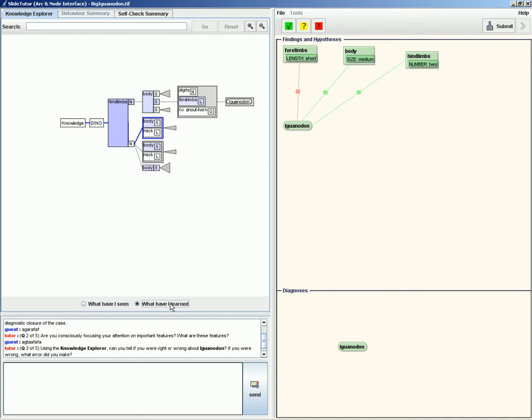What you've seen indicates obviously things that you've seen in the case, in the tutor. The current case is going to be this bright green color that you see here. And anything that you had seen earlier with the tutor, those paths will be colored a light green color. But the current case is this bright green color that you see here. So you just answer the question appropriately.